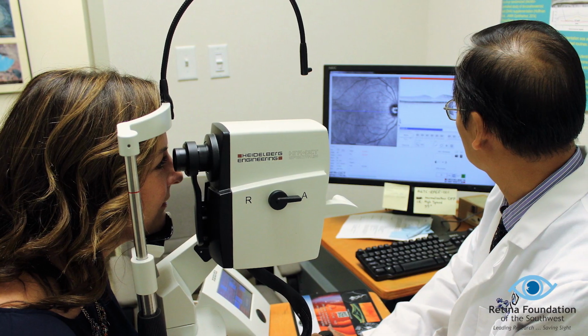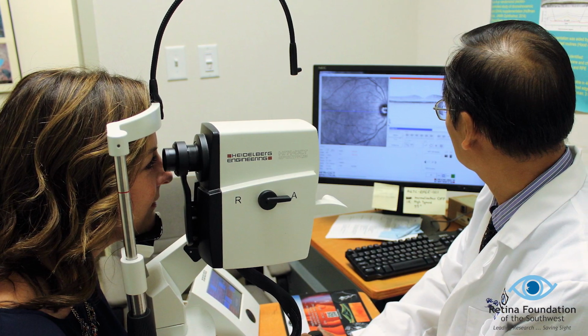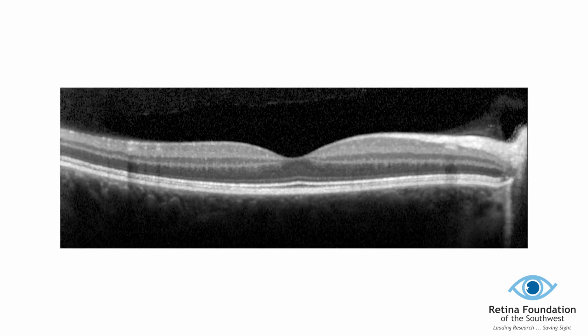While visual function testing allows us to evaluate vision loss subjectively in patients with eye diseases, in clinic, retinal imaging techniques are widely used to assess disease conditions objectively. Advanced imaging techniques, such as optical coherence tomography, or OCT, provide us with new tools to visualize the structure of the retina in high resolution to help identify the defects caused by retinal diseases.